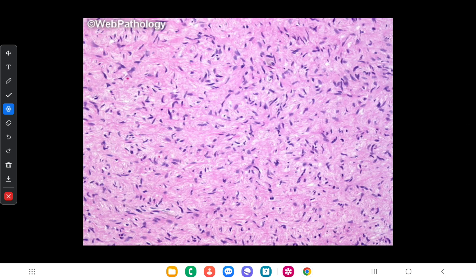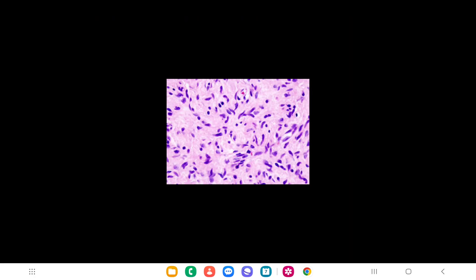Here is a microscopic view of neurofibroma. It contains proliferated Schwann cells and fibroblasts, and there are haphazardly arranged spindle-shaped cells with wavy nuclei that have pointed ends.